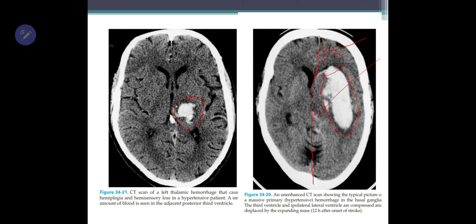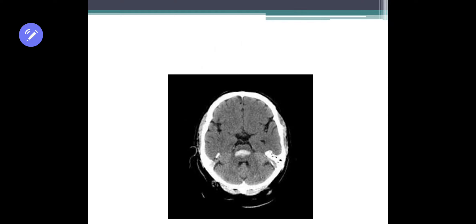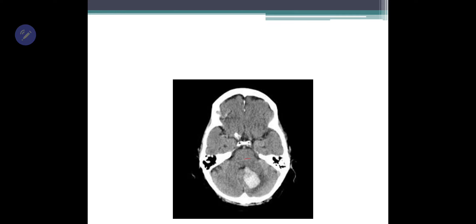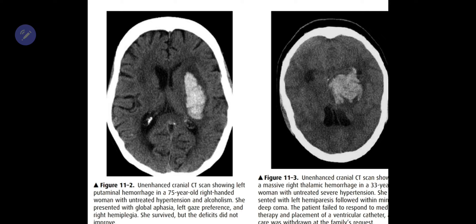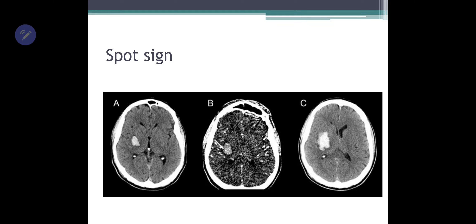This bleed is compressing the ventricles and causing a midline shift. There is also a pontine bleed here and a cerebellar bleed here. You may also see a spot sign — these little spots visible on CT with contrast — which signifies an active bleed.